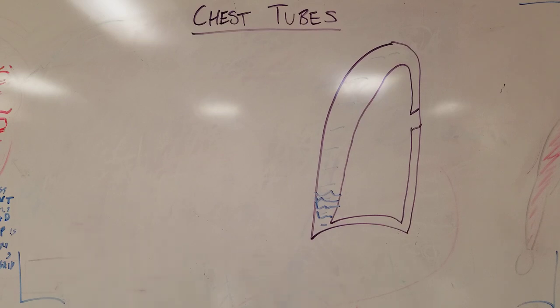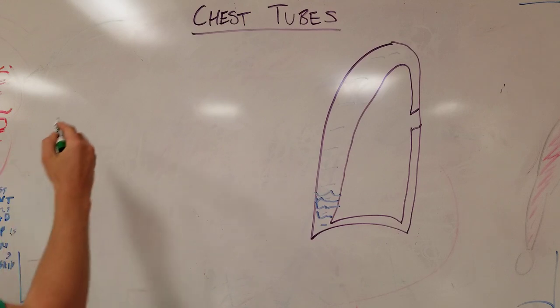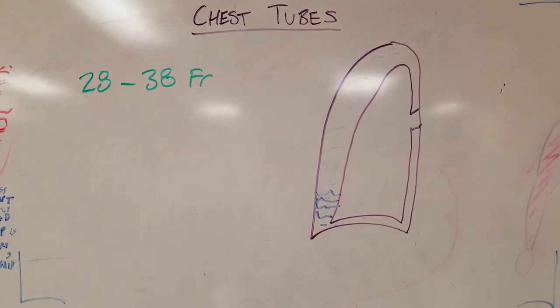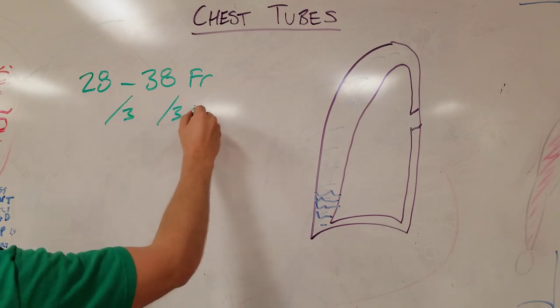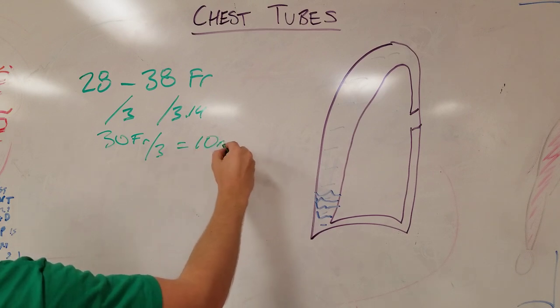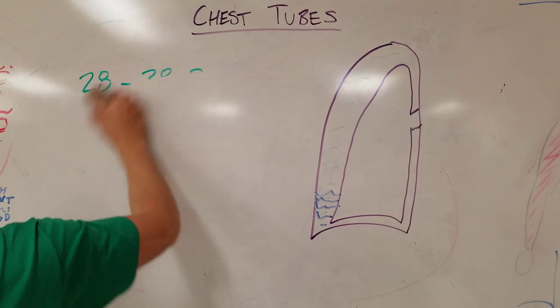So first things first, these chest tubes are going to come in a whole host of different ranges of sizes. The ones we're going to talk about for trauma are usually going to be somewhere between the 28 to 38 French size. French is a type of measurement, the poor man's way to determine how big that is: if you divide this by 3, or some people say pi, you get the size in millimeters. So if you had a 30 French chest tube, divided by 3 is about 10 millimeters wide. So it gives you an idea of how big these chest tubes are. 30 French, which would be in this range of trauma, is about 1 centimeter wide. Okay, boom, now I got that out of the way.